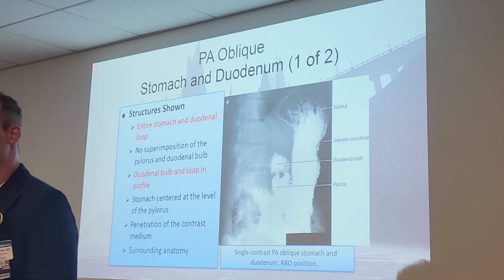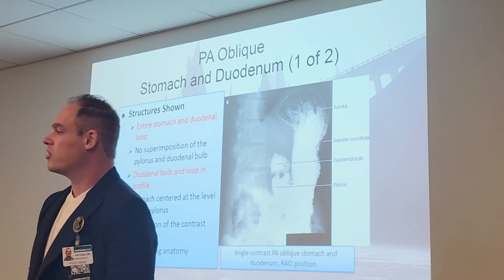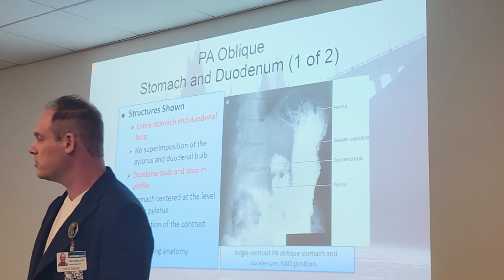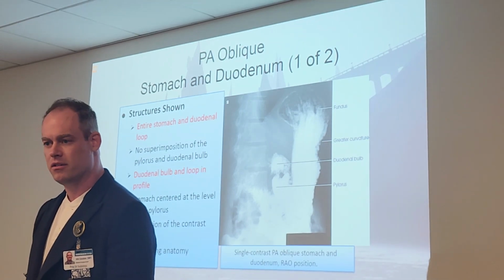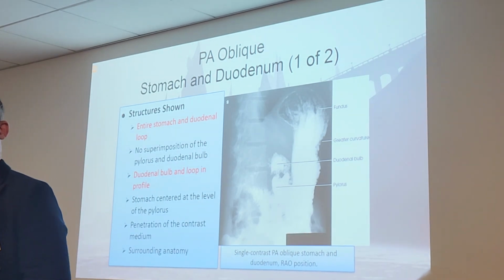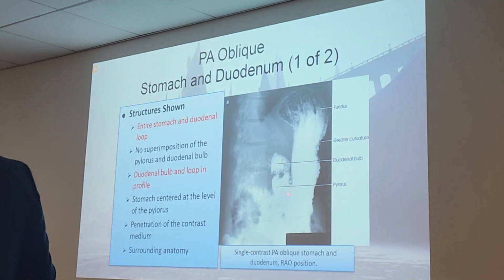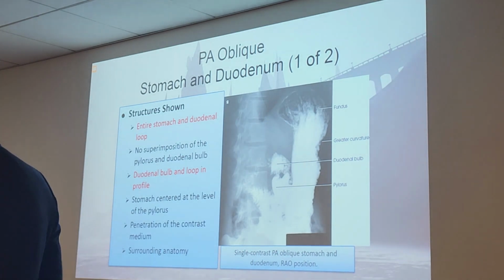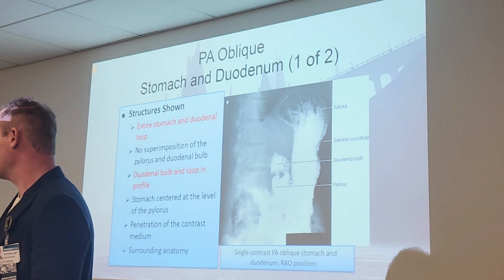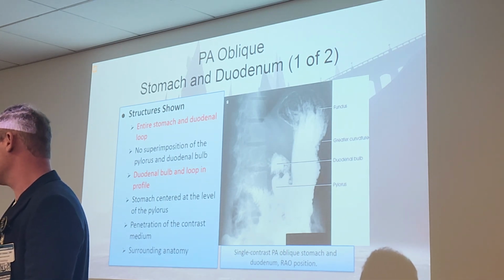Basically, this position is going to let us see the duodenal bulb a little more clearly, thus it's going to be in profile. So if you had a question that says which of the following upper GI projections would put the duodenal bulb in profile, it would be the RAO. The RAO is specific for that. And there you can see contrast in the body and pylorus, air in the fundus, even though it's an RAO. This position puts the duodenal bulb and the loop in profile, but primarily the duodenal bulb is the main reason we do this one.